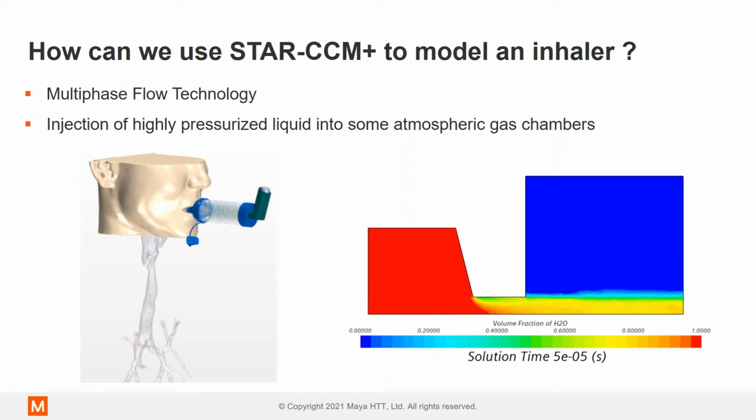So in this case, we're displaying volume fraction of water in red, and there is air in blue. The vapor is displayed in the green region around the inlet of the nozzle. Why is this important? Because in a case of an inhaler, we want to know how much liquid is going through to the patient and maybe even understand the actual dosage required. We want to know where the cavitation appears and how the flow is behaving in the nozzle.